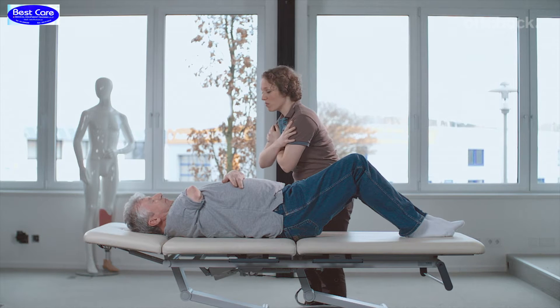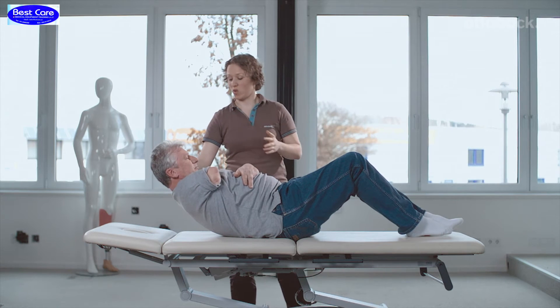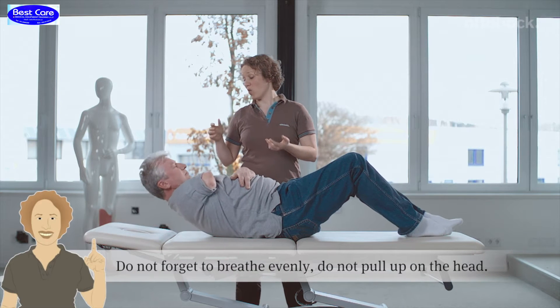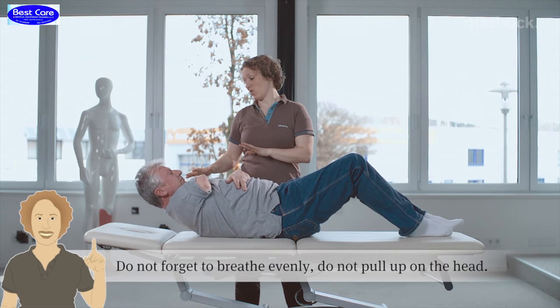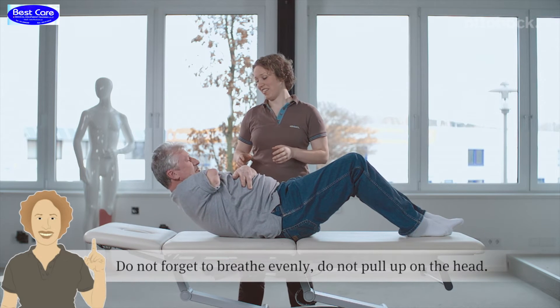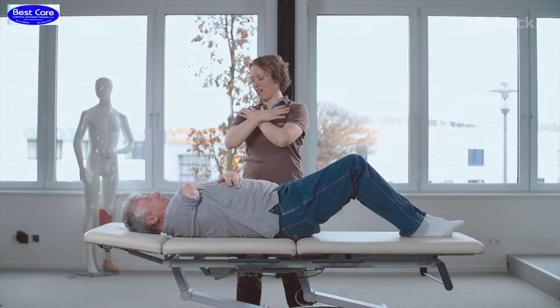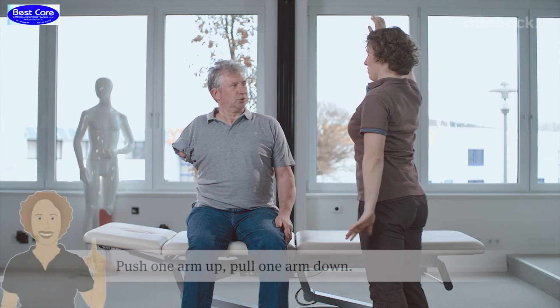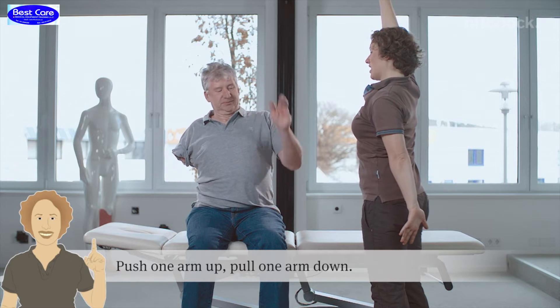But as soon as you have the prosthetic and the patient is there for the trial, you will find out that there are a lot of points you did not ask the patient about. It is important to know these things before making the limb or deciding which kind of prosthetic to use — this will help you a lot and will improve your relationship with your patient.